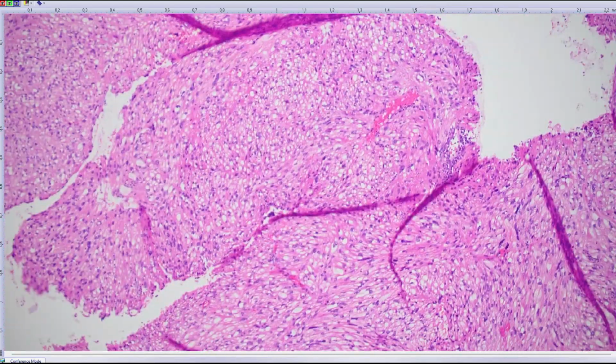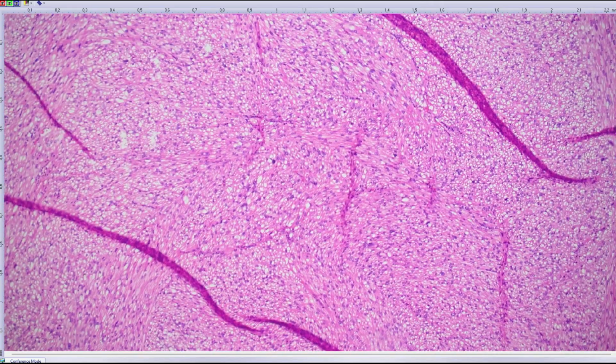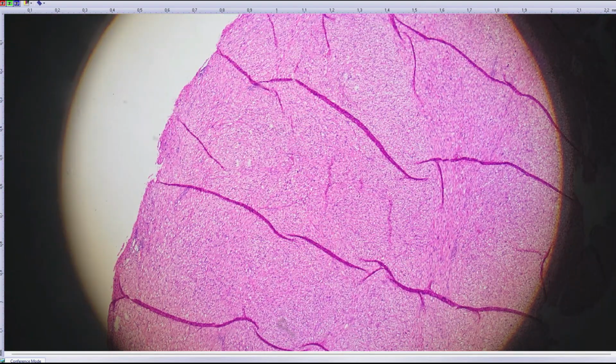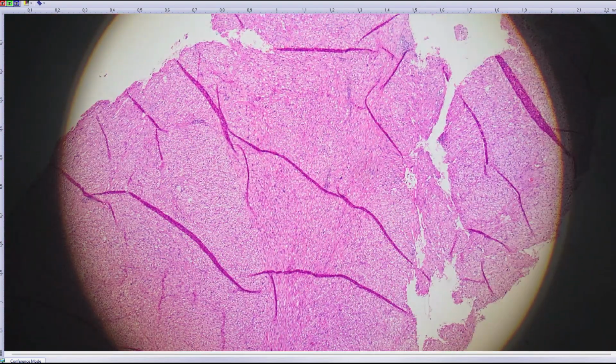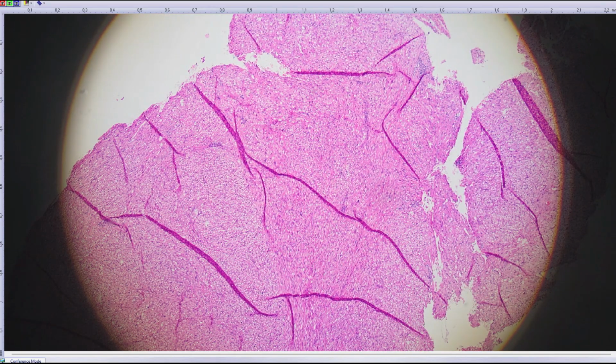The tumor didn't cluster with leiomyosarcomas and was kind of overlapping with the PEComa group, although from what I've learned, the PEComas don't form one single group in the methylation classifiers, but by visualization it was elsewhere than the leiomyosarcomas. So, given the morphology, the immunophenotype with the GPNMB expression and the methylation features, I will call this PEComa. So that's it from me. Thank you.